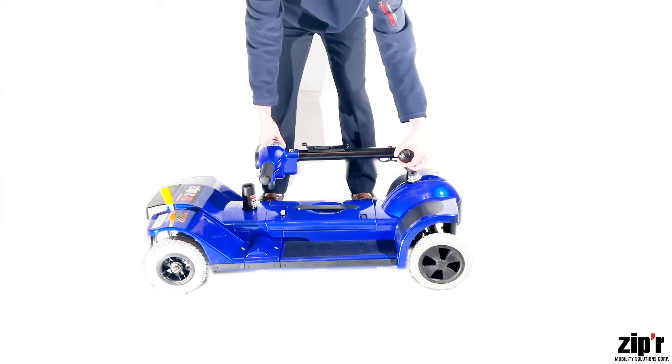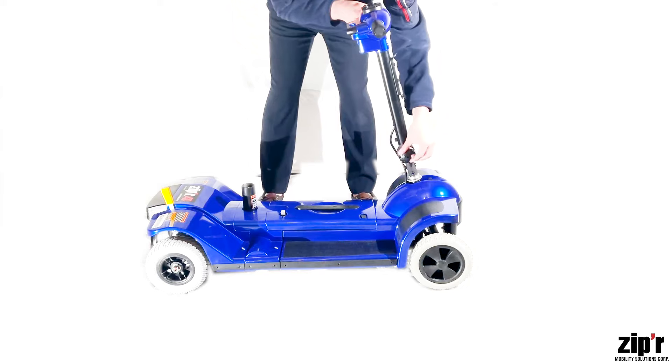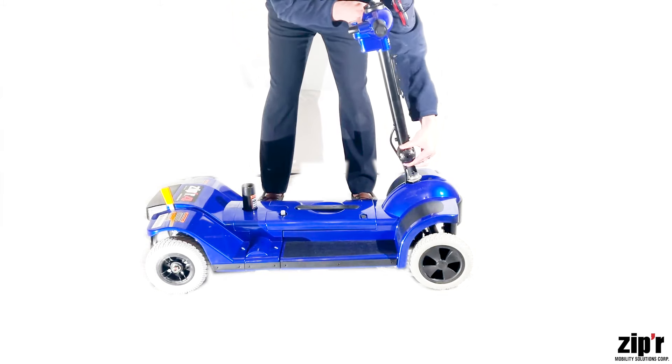Next, you'll want to unscrew the tiller knob and raise the tiller. Tighten the tiller knob to secure the tiller into place.